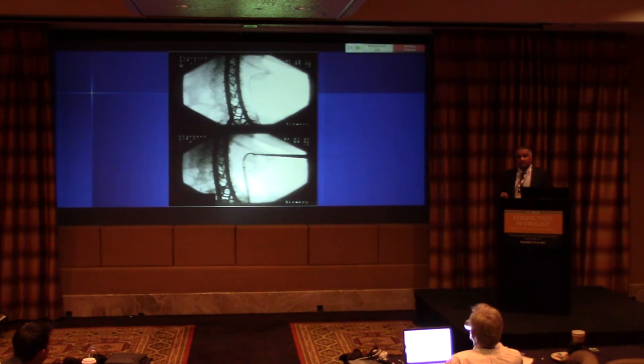The supine folks say, well, the other advantage of supine is you can do your ureteroscopy, and this is just to show that you can do that in the prone position also. You already have your access sheath in to gain your access. This is a child where we did an endoscopic puncture, removed the bulk of the stone, but there was some stone here that we couldn't access through this angle.